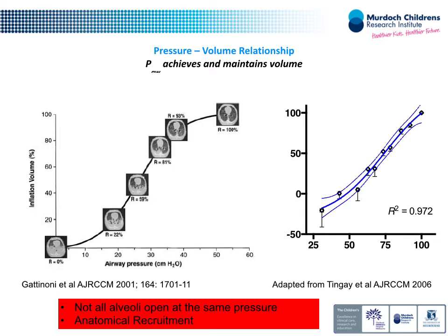And on an oscillator, essentially our mean airway pressure is a PEEP change, isn't it? It's a static change. On a conventional ventilator, pressure and volume do this, but on an oscillator it's doing this. So if you make a little change, you'll get another static change. Here's some data from our work where we did a series of mean airway pressure changes and measured lung volume.